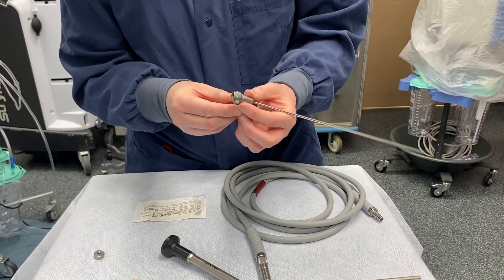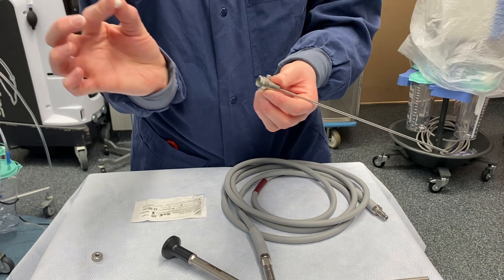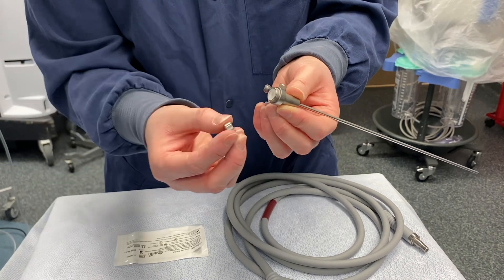For our outflow sheath, we will do the same thing with the white seal. Bubble part points to the end of the scope, and you'll screw on the metal cap.